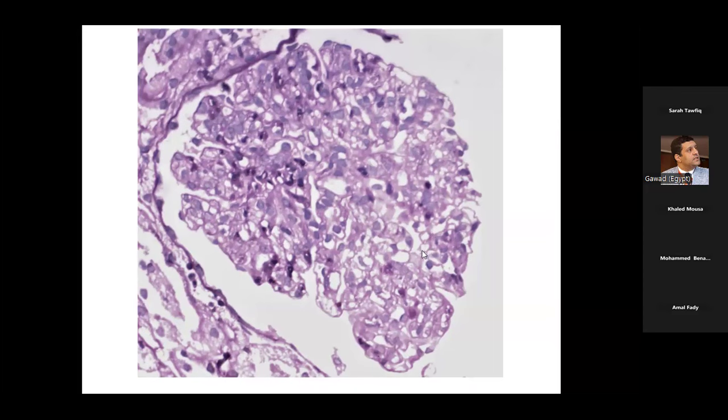We have the first answer, it is mixed. So we have some open and some closed. Yes, that's right. Some are answered as occluded. Okay, it's mixed, right? It's a segmental occlusion. But with which type of cells?